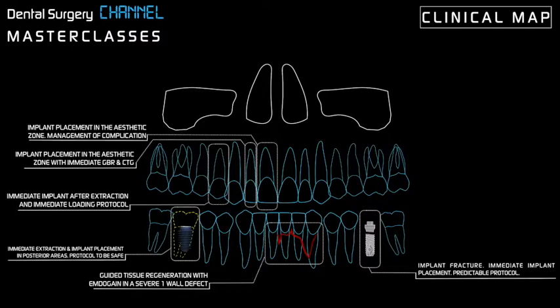What if the implant platform is completely broken and we don't have advanced systems that would remove the implant very easily? So in this case, you're going to be able to see the clinical management, but also always finding the reason why the patient ended up having an implant fracture in order not to have a relapse, a new case of implant fracture. It's very important also to make smart decisions according to the classification. This will drive our decision-making process.